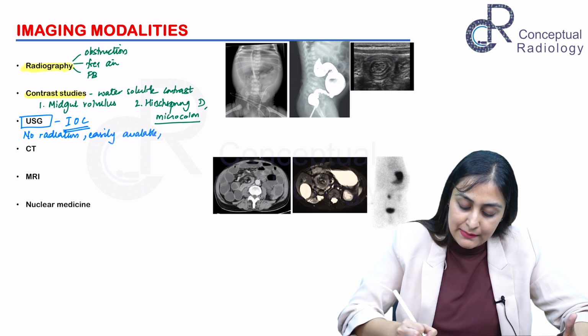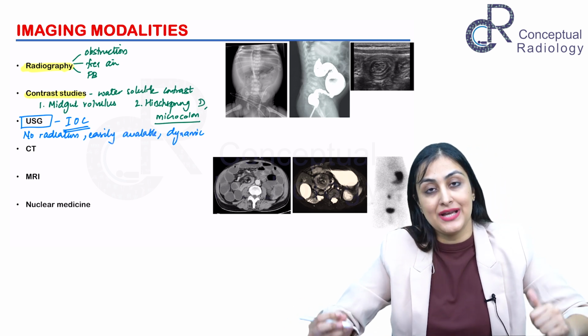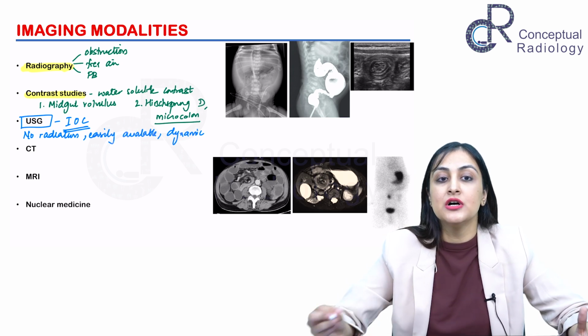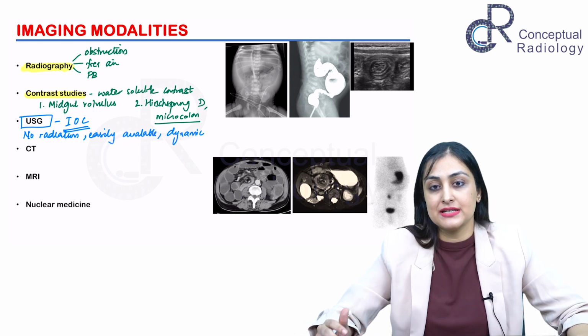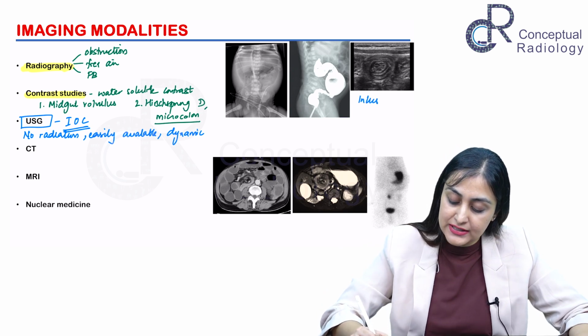It's a dynamic investigation. You know your kids are not going to stay still for a long time. This is something which ultrasound can take into account. So dynamic evaluation is possible here. So all of these are the advantages. It's portable. You guys know it. So ultrasound is the investigation of choice, particularly useful in cases of intussusception.